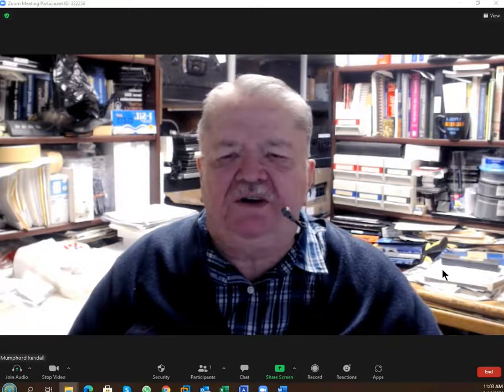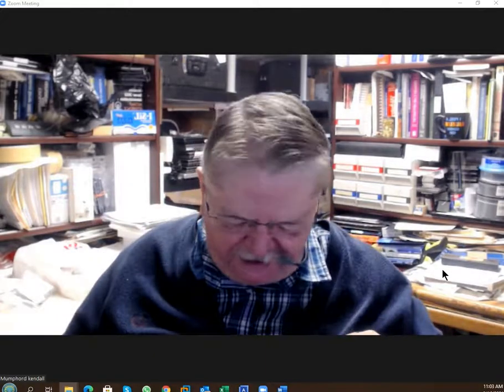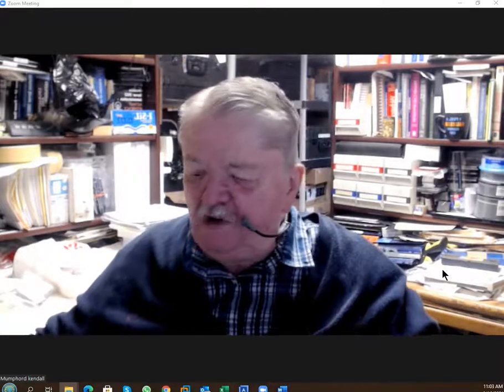So fitting glasses is important. You need to widen the bridge sometimes right there. Sometimes you find that they don't go in far enough, so you may have to bend it in like this until they're tight on the side of the head. So a variety of things, but the key thing to remember is when you're fitting a person with a pair of glasses, make sure that they're positioned properly on their face, and then when you put the pair of glasses on, like I did with this pair right here, they should be able to do like this and it not move out of position. Hopefully this will be helpful for you.